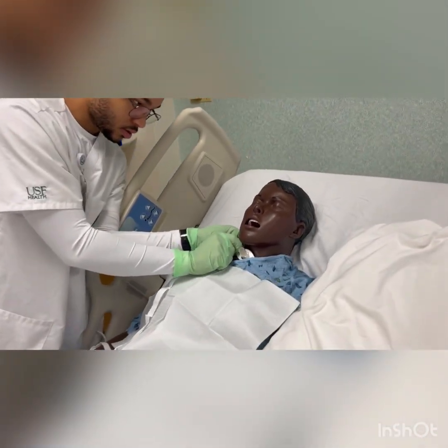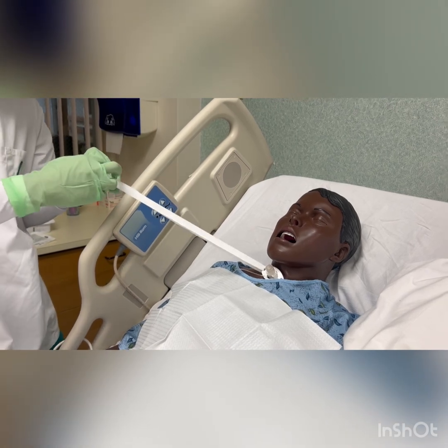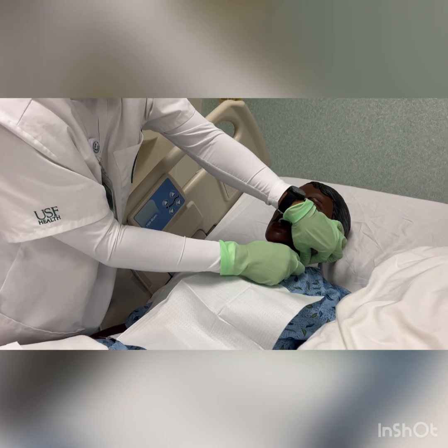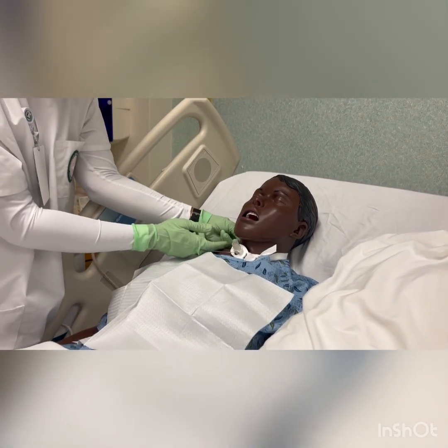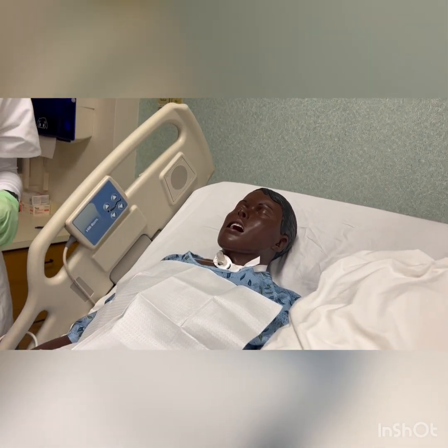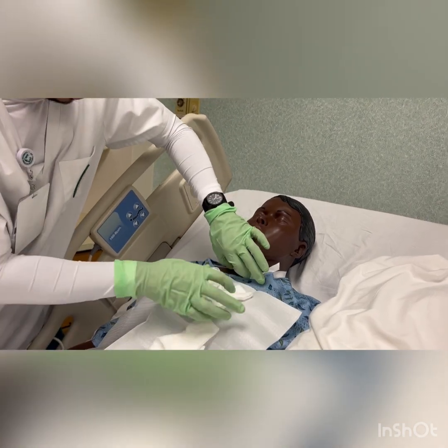You want to make sure that the new tube holder is tight, but not too tight, and you should be able to fit 2 fingers under there. We also want to make sure that it's secure, that way the tube doesn't move out of place or anything like that. After ensuring the security of the new tube holder, apply gauze pads as needed.